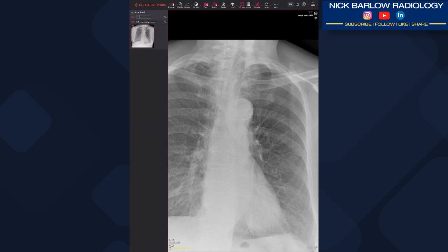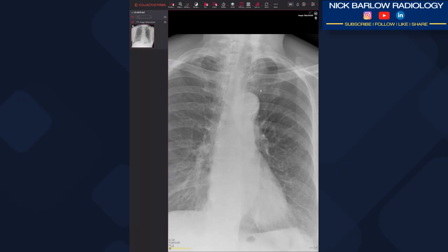Now if you're a radiographer — the reason I'm describing this case today — if you're in this position, just do the apical lordotic view at the time with the patient there. It saves them having to come back in and makes the job a lot easier. If anybody questions what you're doing, you're autonomous; you should be able to make decisions on the best projections for the clinical question. As long as you can justify what you've done, there'll be no issue.